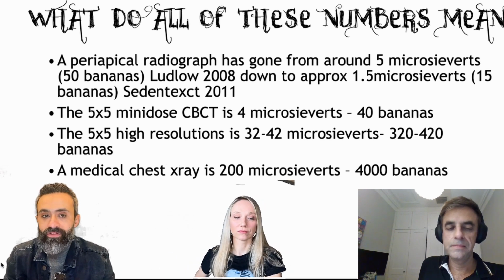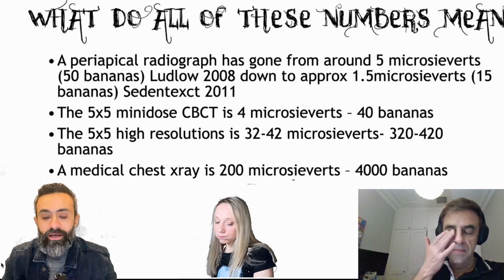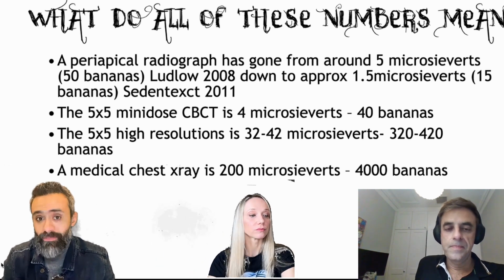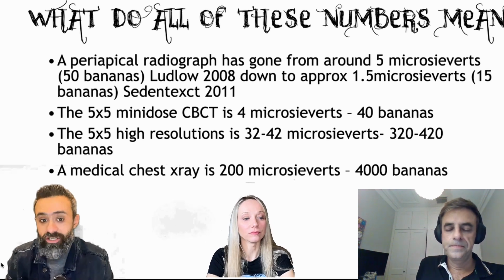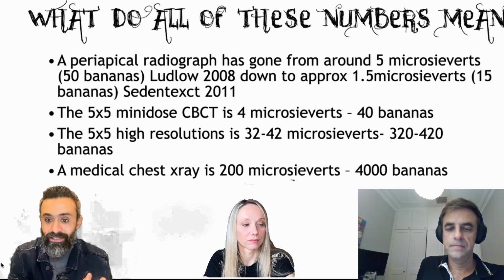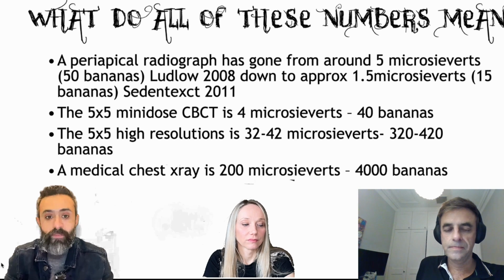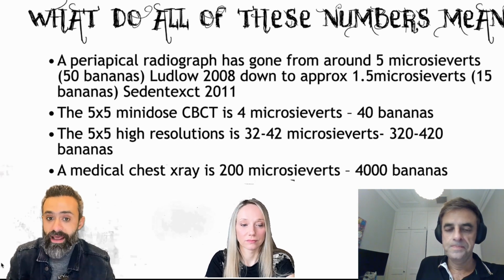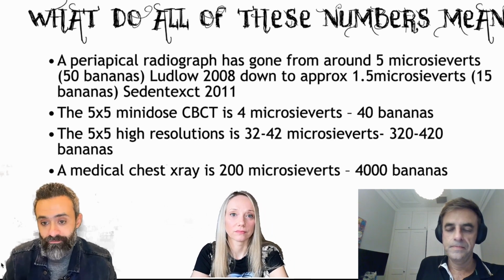I remember that there was an article in 2017 in the Journal of Endodontics discussing the influence of CBCT on clinical decision making among specialists, especially in difficult cases, and how they changed their opinion or decision after seeing the case on CBCT. So, can you give us some examples of how CBCT can make the clinician decide when to treat, when not to treat, and how to treat, and how it guides the treatment plan in general?